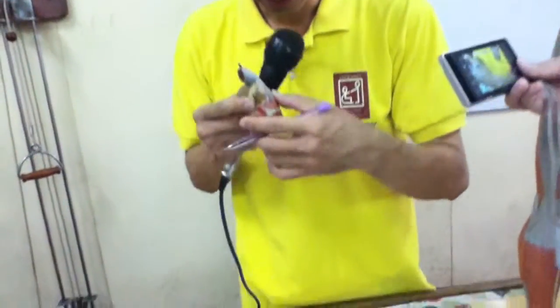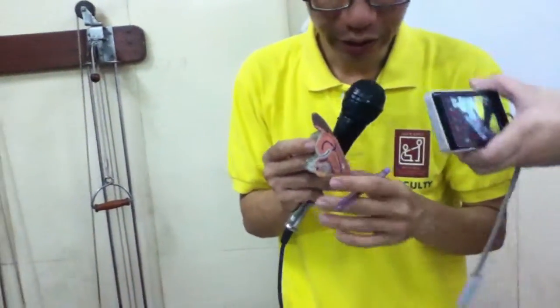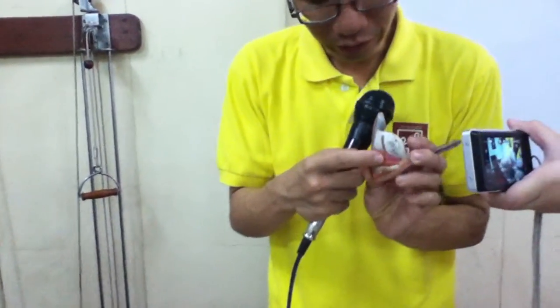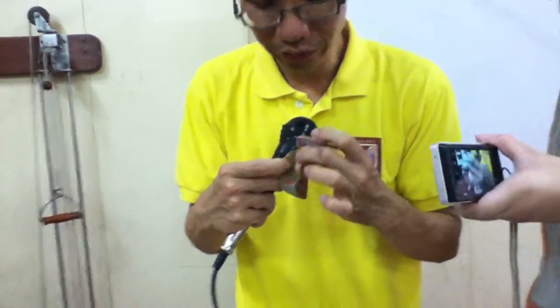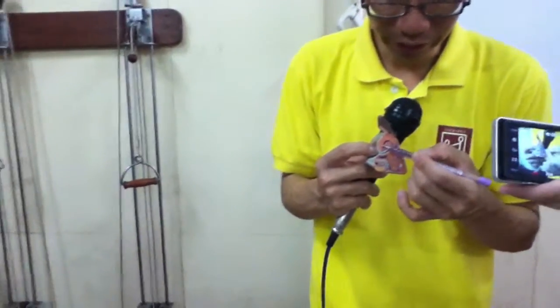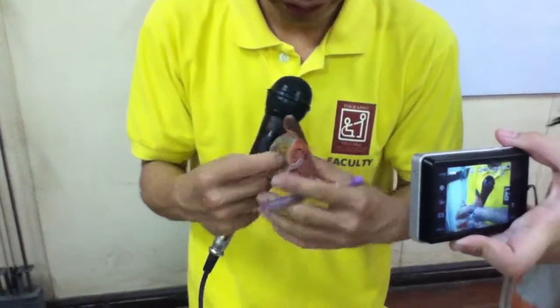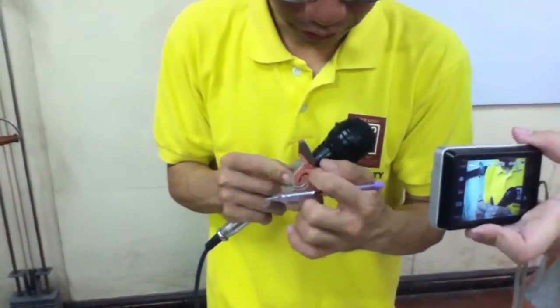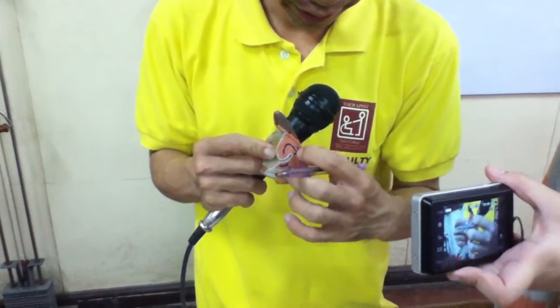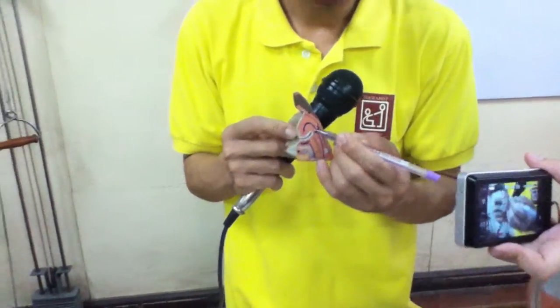None? Okay. So, we're going to open that. This is the sagittal view there. So a while ago, we mentioned the uterus. So this would now be the uterus. So this is now the cavity of the uterus. Cavity. Here, because it is the uterus. So on your right, this would now be the cavity. And then, at the end of the uterus, we call that part now the cervix. The cervix.